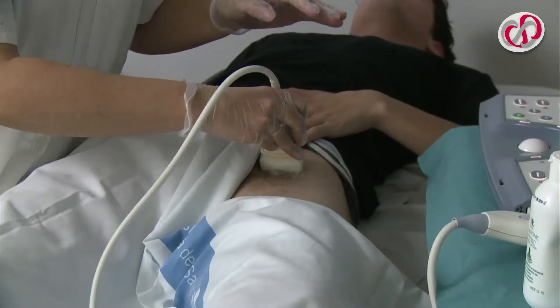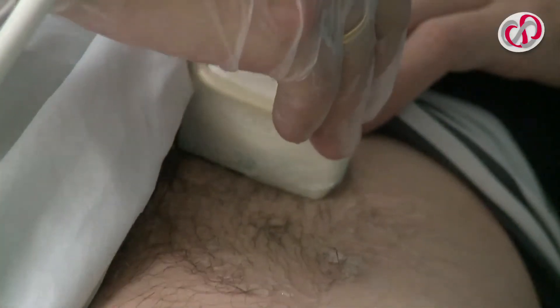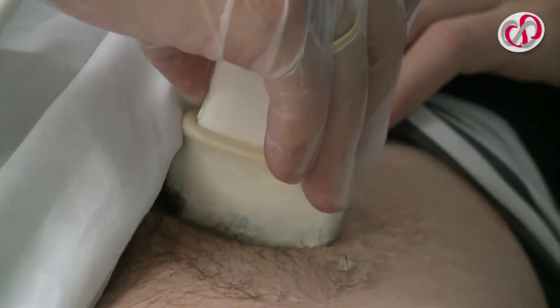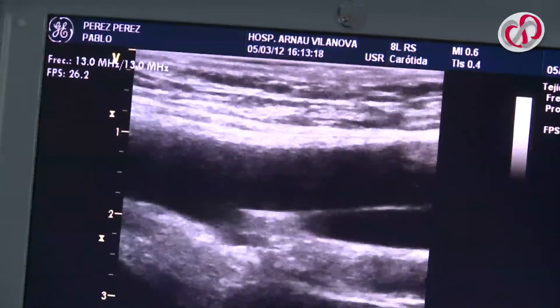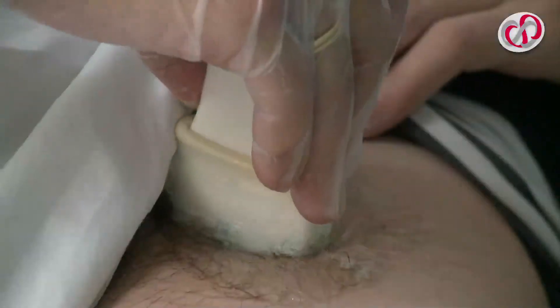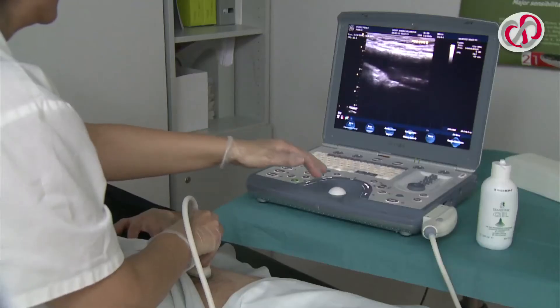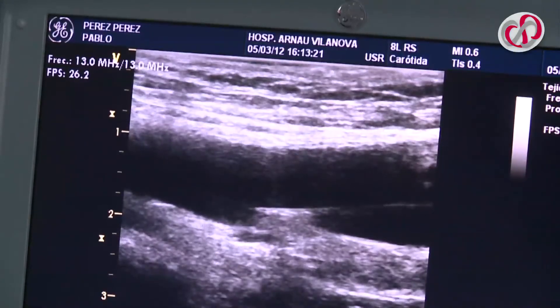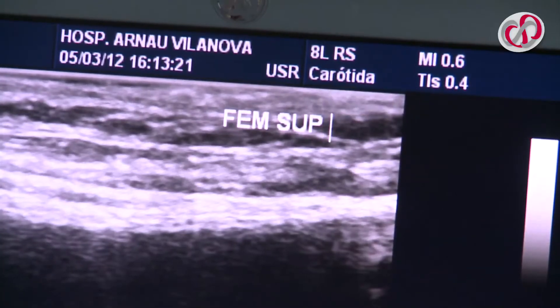To obtain a good image of the superficial femoral artery, we make a cross-sectional exploration as far as the bifurcation. At this point, the probe is rotated to a longitudinal position until a good image of the superficial femoral artery and bifurcation is obtained. The image is captured, correctly identified and saved.